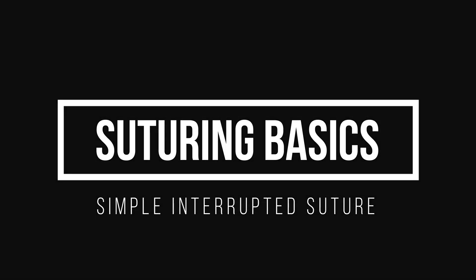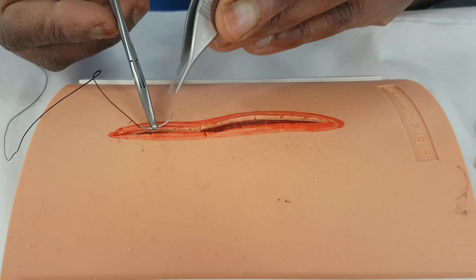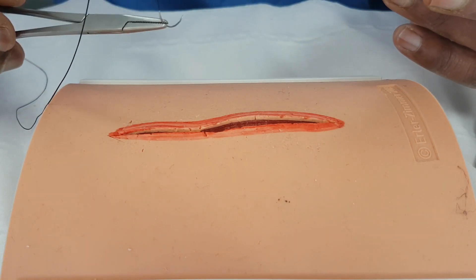Let's start suturing. I've got my needle mounted two-thirds, one-third along the way, and we're going to do some simple interrupted stitches.